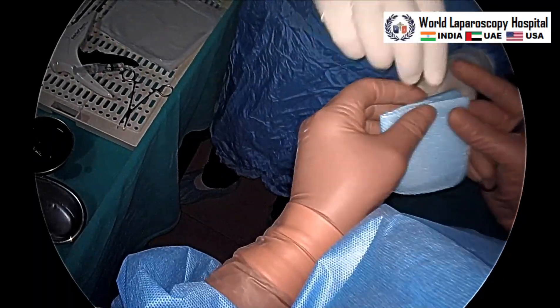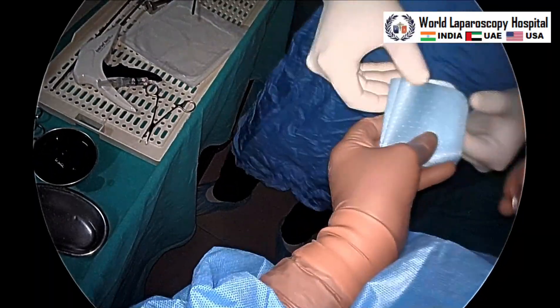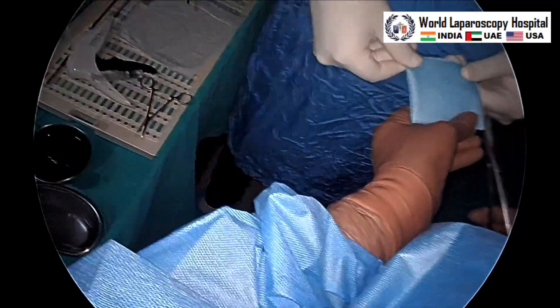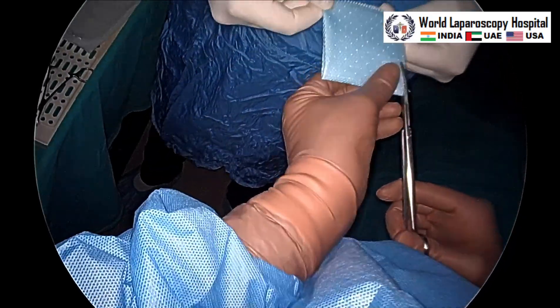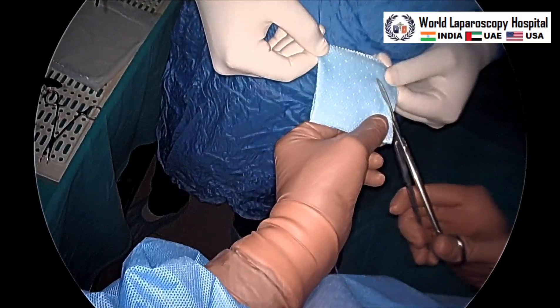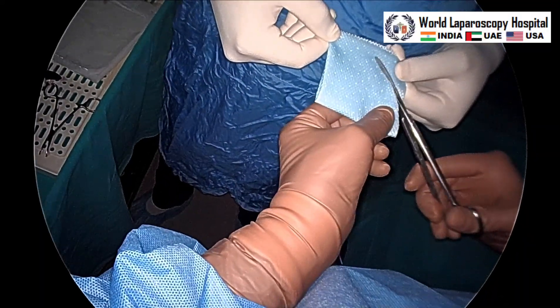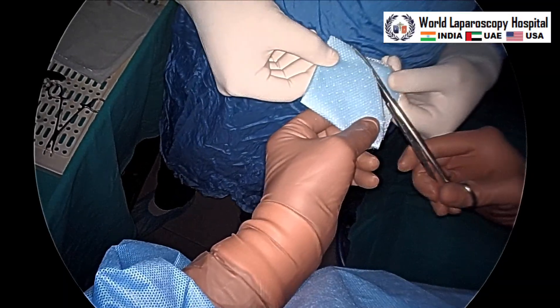We are using a dual-side mesh here — that is a polyurethane mesh which is made for intraperitoneal application. This is a 15 by 15 size mesh because the hernia is only 2 centimeters. So we are trimming the mesh to make it 14 by 14 and making it circular.